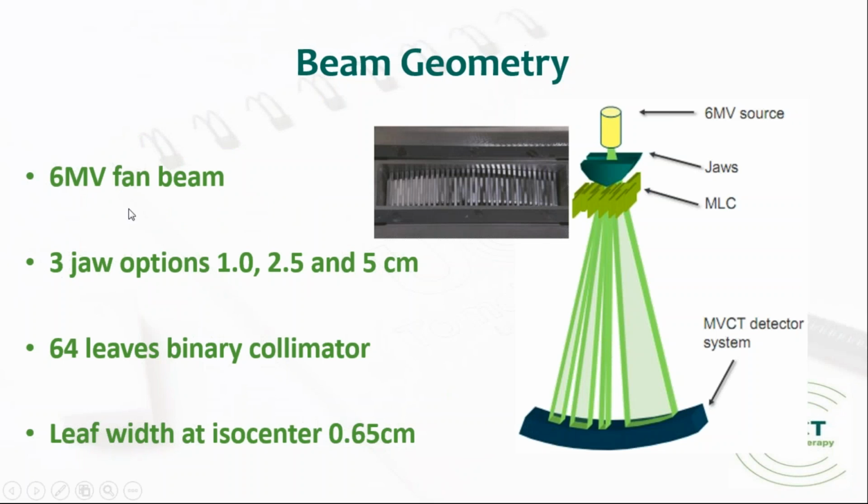We have a 6 MV fan beam, with 3 jaw options, and a 64-leaf binary collimator, you can see its photo here.